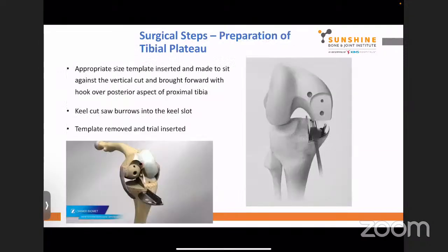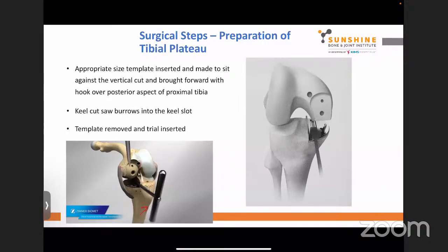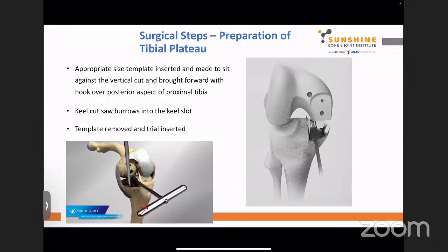So once you've finished your balancing part, you have to now prepare the tibial plateau. Appropriate size template is inserted. So you have different sizes of these tibial base plates. Sit against the vertical cut and brought forward with the hook over the posterior aspect. The keel cut saw burrows into the keel slot and the template is removed and the trial inserted. See what happens. You put in your proper size. Then you get this hook to go to the back. Hook it over the posterior edge and pull it forwards. Hold it with this pin.